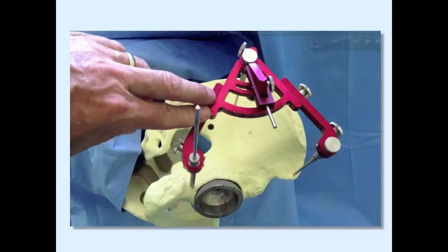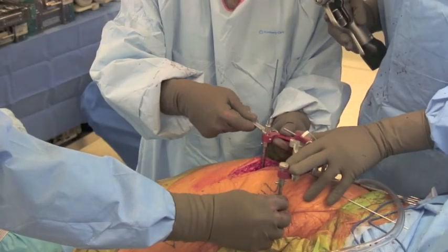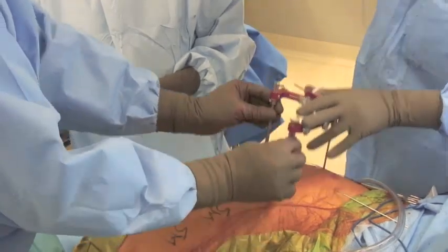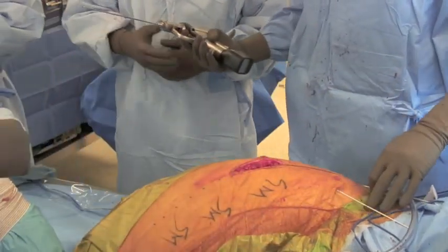Once the cup is implanted, check to see that it is fully seated before removing the HipSextant. Then loosen the base point collet using the 7 millimeter wrench. Remove the base point pin and then remove the instrument.